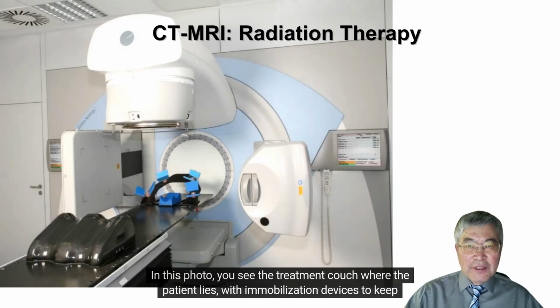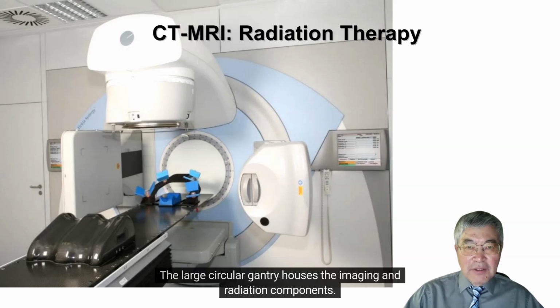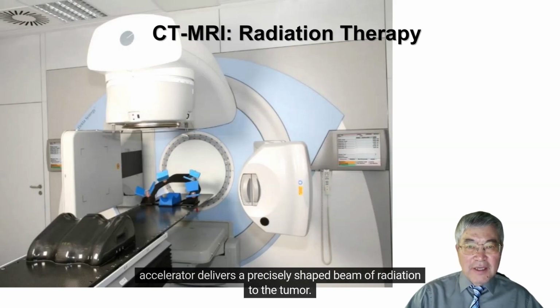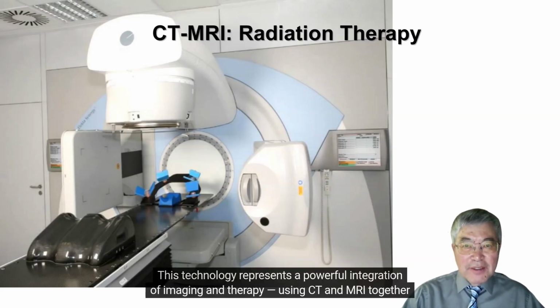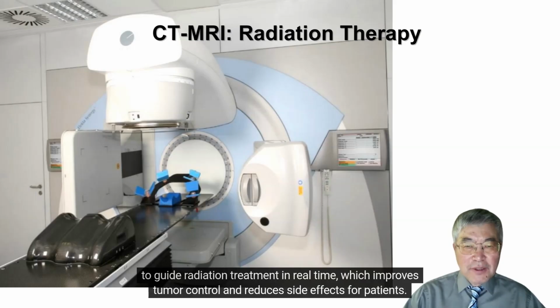In this photo, you see the treatment couch where the patient lies with immobilization devices to keep the patient still. The large circular gantry houses the imaging and radiation components. During treatment, the system acquires imaging data to confirm the tumor's position, and then the linear accelerator delivers a precisely shaped beam of radiation to the tumor. This technology represents a powerful integration of imaging and therapy, using CT and MRI together to guide radiation treatment in real time, which improves tumor control and reduces side effects for patients.